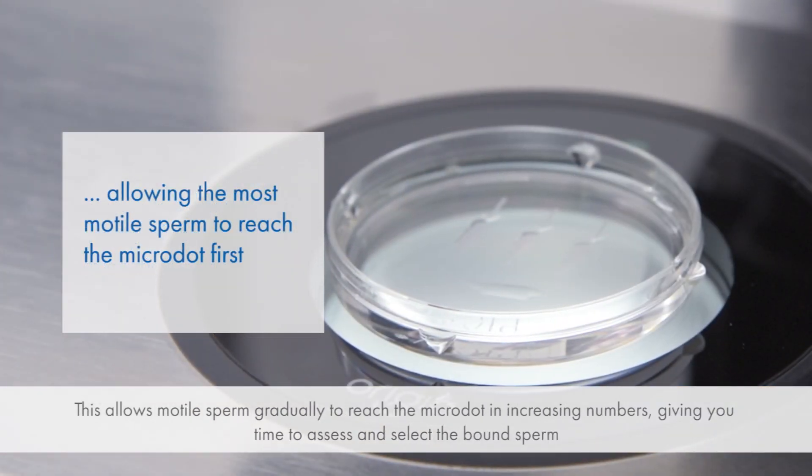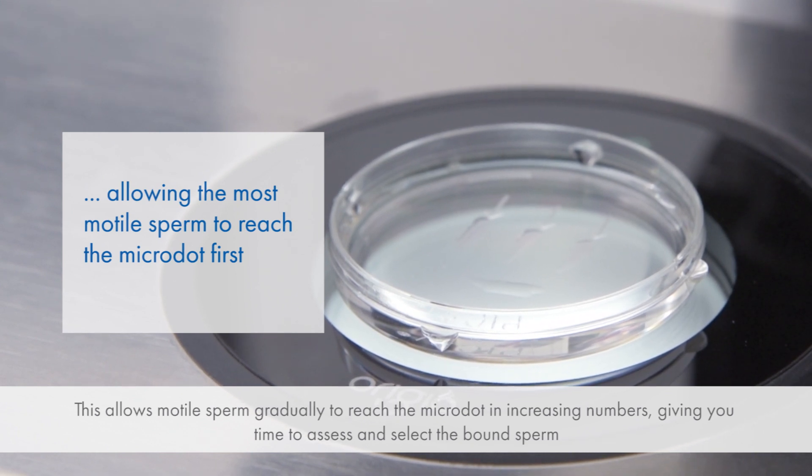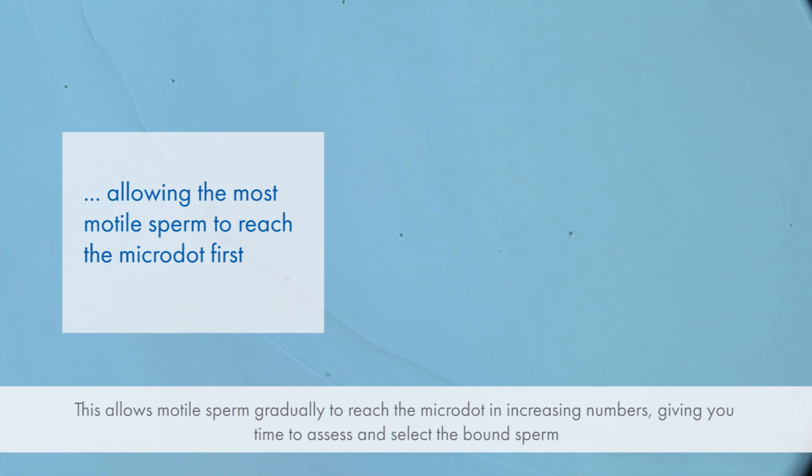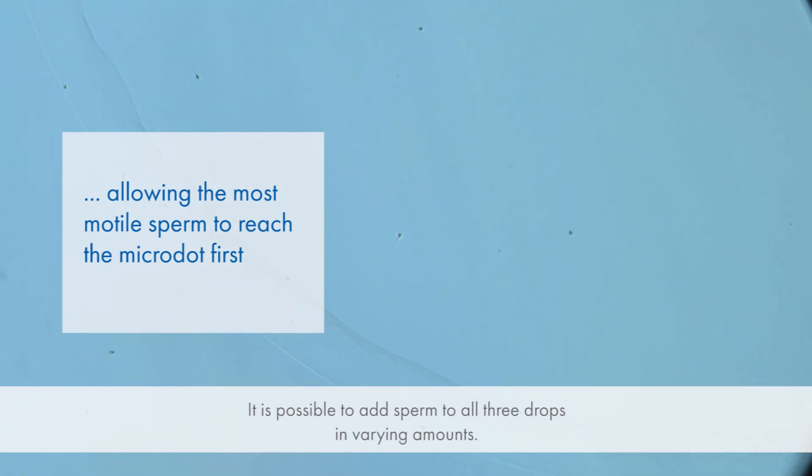This allows motile sperm to gradually reach the micro dot in increasing numbers, giving you time to assess and select the bound sperm. It is possible to add sperm to all three drops in varying amounts.